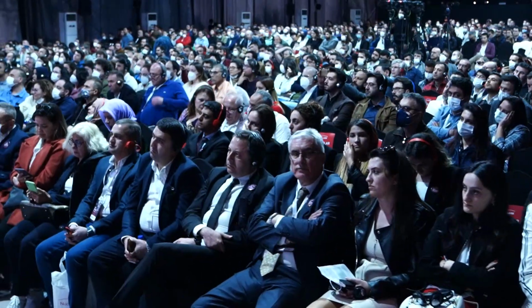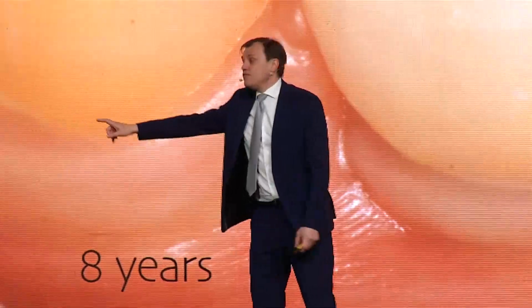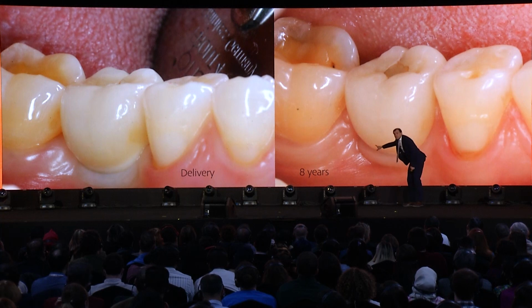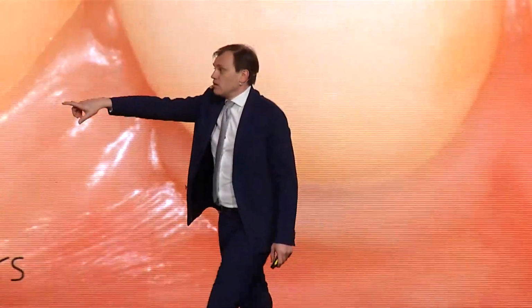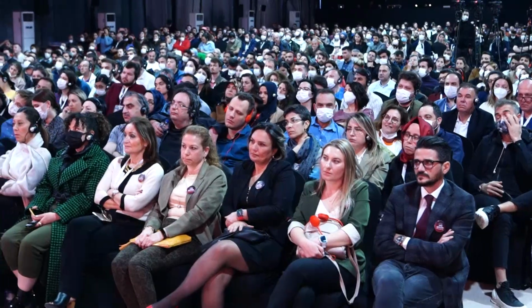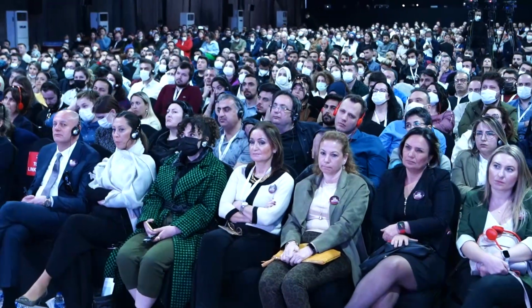And this is the final restorations, delivery, 8 years follow-up. Prosthetic grafting, new term. Almost no keratinized tissues at the delivery. After 8 years, I have a sufficient amount. How about bone stability?